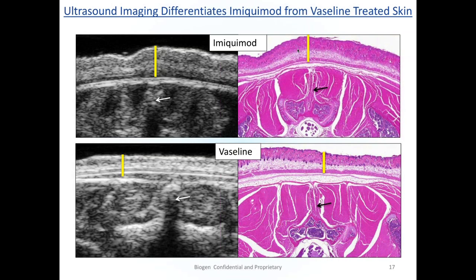So it's another complexity of running all of these skin models in the mice. It always had to be synchronized. In any case, the control and the treated groups all had to have hair removal on the exact same cycle, because it can certainly change your readouts in the skin.